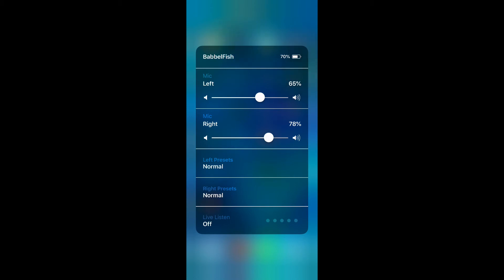You've got full control of left or right volume by sliding those sliders. You can change programming by selecting the left or right presets and you can even turn on live listen.